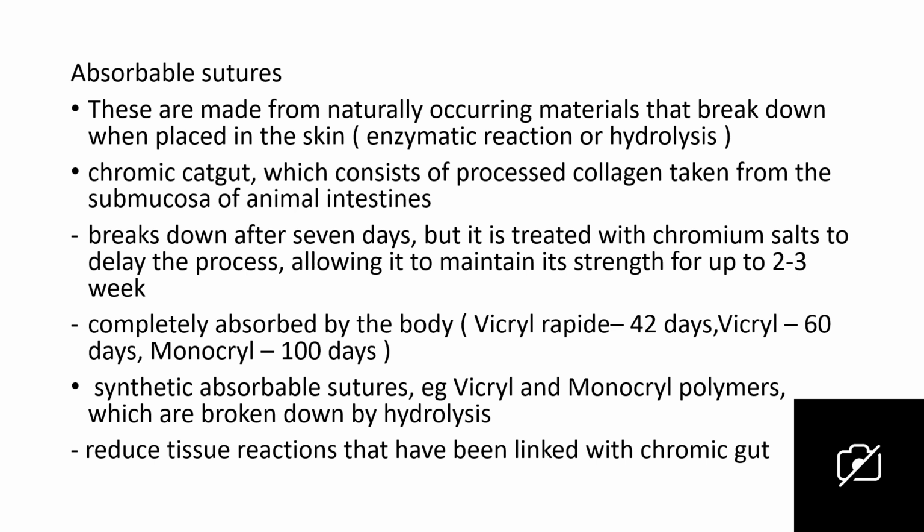Synthetic absorbable sutures, for example Vicryl and Monocryl, are polymers which are broken down by hydrolysis. And then you also reduce the tissue reaction that has been linked with chromic gut.